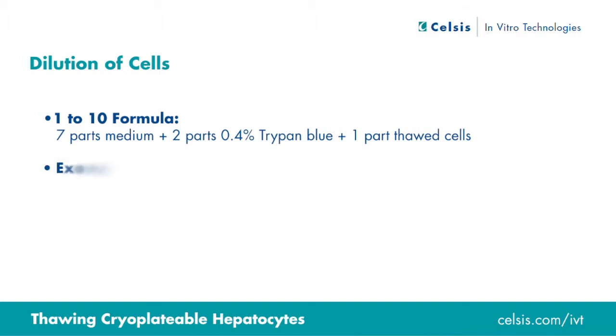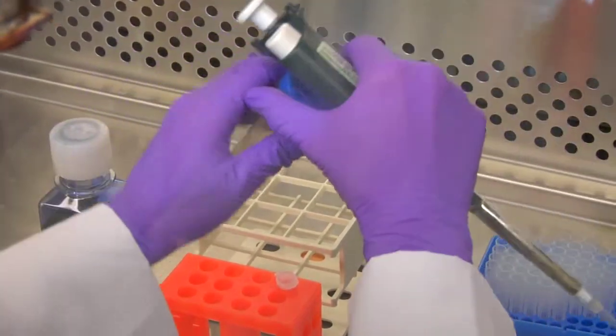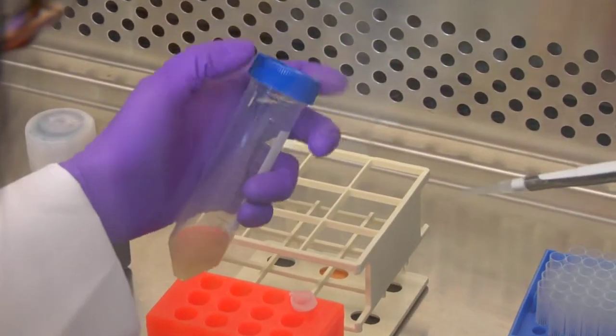An example of this 1 to 10 dilution is 700 microliters of InVitroGRO CP medium for cryoplateable cells, 200 microliters of 0.4% trypan blue, and 100 microliters of thawed cells. Mix and incubate at room temperature for one minute. Be sure to mix the cell suspension thoroughly before taking an aliquot. The cells are ready to be counted.